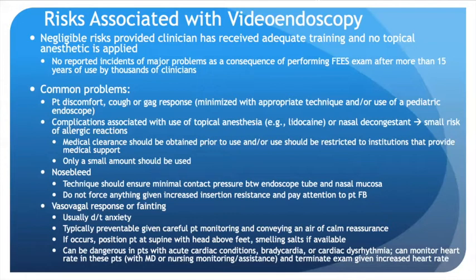That's one of the best ones, or possibly nasal decongestant. And these include a small risk of allergic reactions. So to mitigate this, medical clearance should be obtained prior to the use of these anesthetics, and/or you should be restricted to institutions that provide medical support. And you should only use a small amount of anesthetic when you are using it.